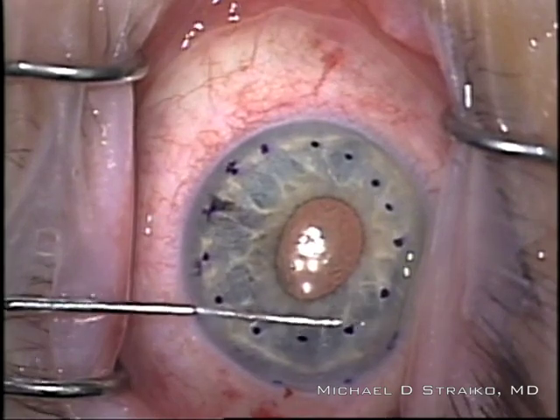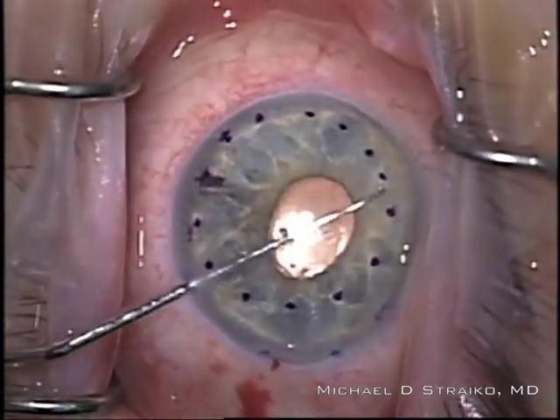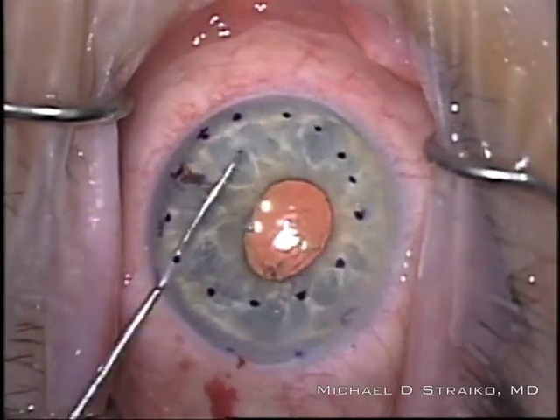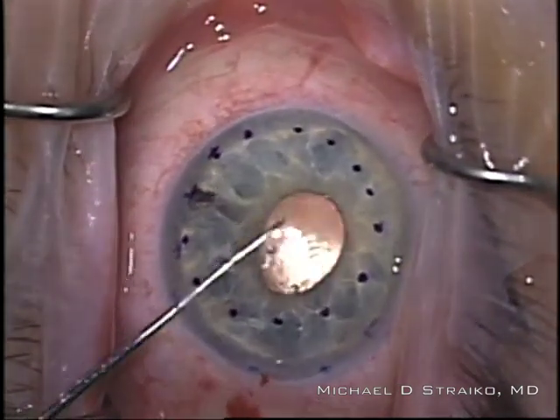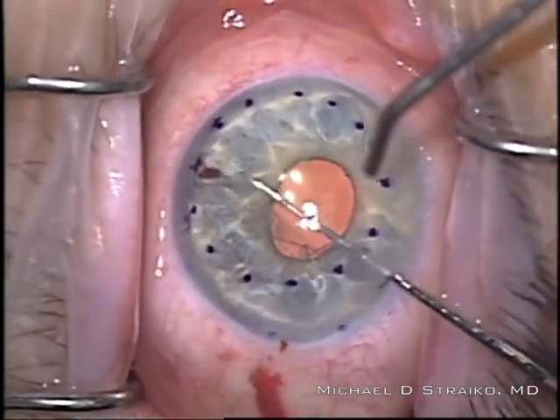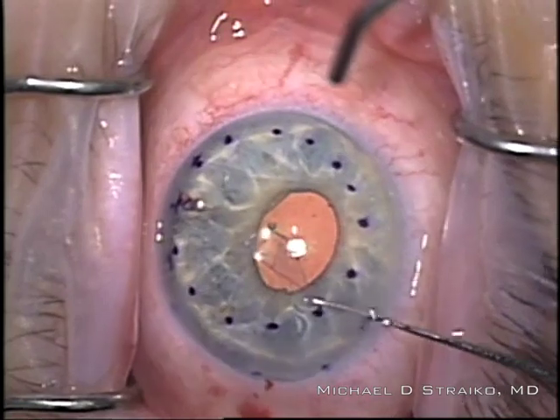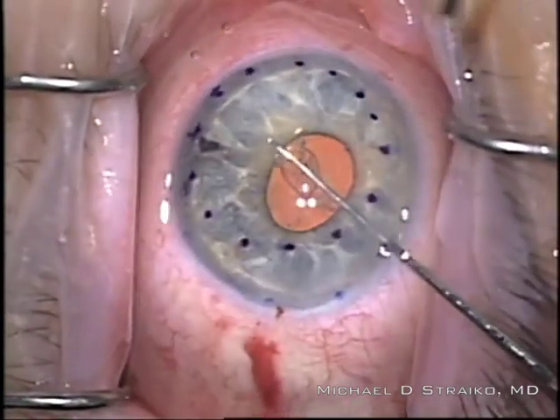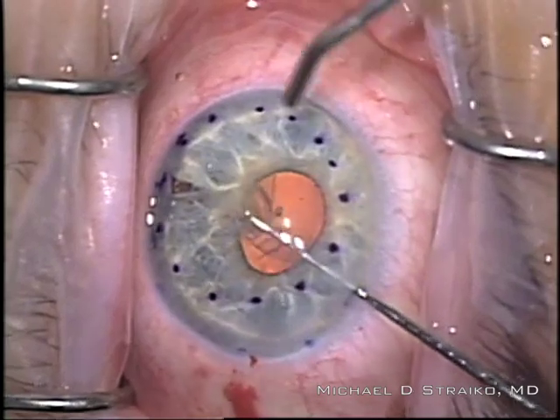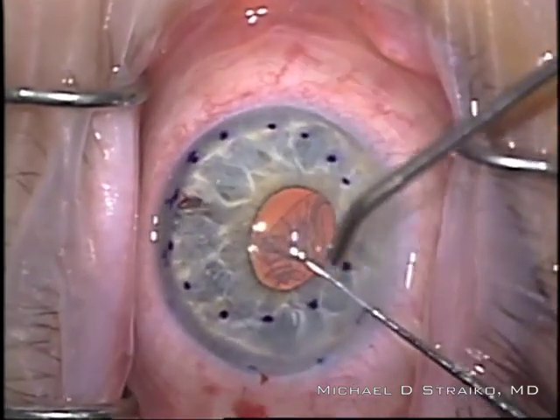You'll see her surface is not that great — that's from long-standing edema. Pre-operatively she had 20/100 vision best corrected. I'm now just gently peeling the Descemet membrane into the center of the eye, really taking my time not to engage any of the stroma whatsoever. Once I get it in the center, I give it a little swirl and push up on the Descemet. I'm always trying to rub the patient's Descemet onto the remaining Descemet so I'm not directly touching the stroma with the tip of that reverse Sinski.